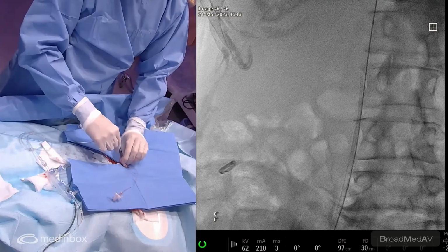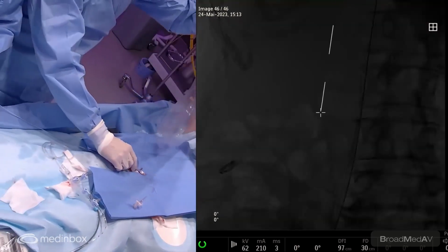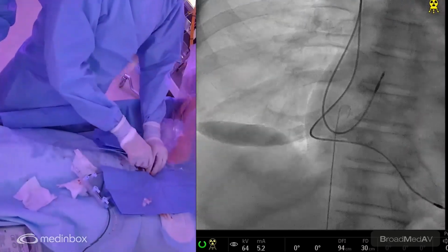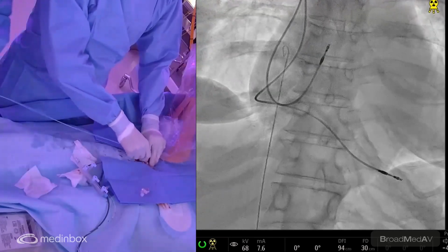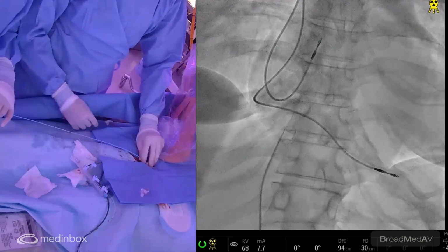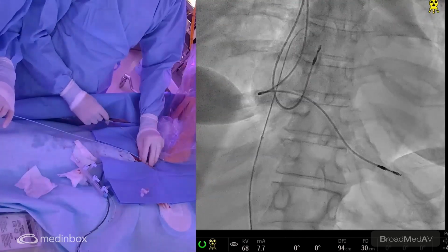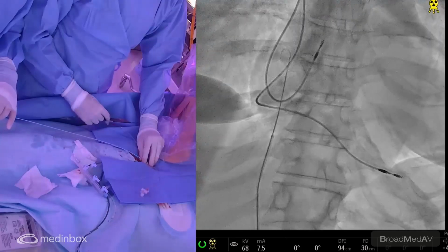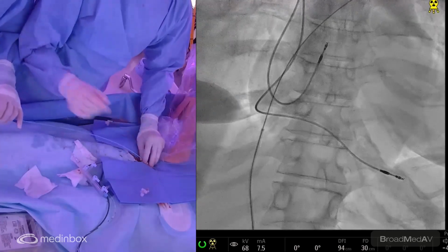Okay, all right, let's go. So it's a multi-purpose, six French. Typically, I like to start on the left side first. So from the IVC, when there's a significant PFO, typically when you put your multi-purpose like this in the IVC and you push your wire, typically it's not too difficult to cross the PFO. And I think it was the case here. Yeah, I think you were there for a split second. Yeah. Right, so this is now across the PFO.